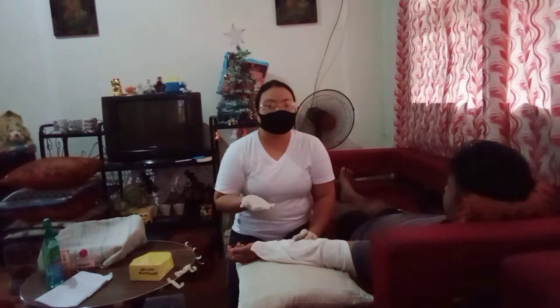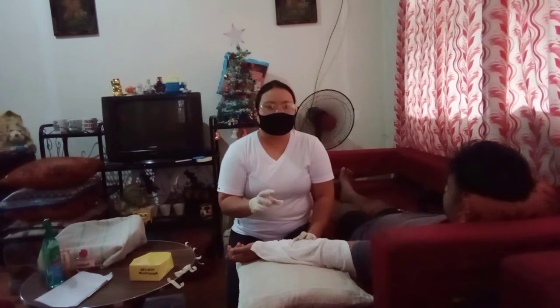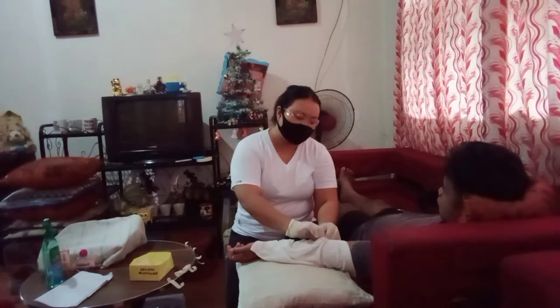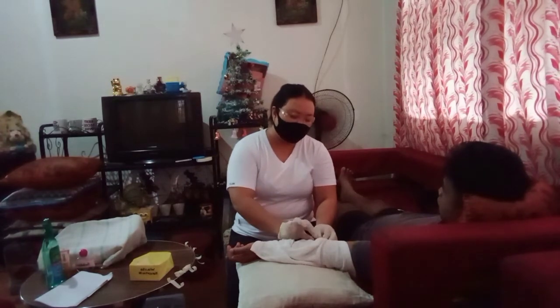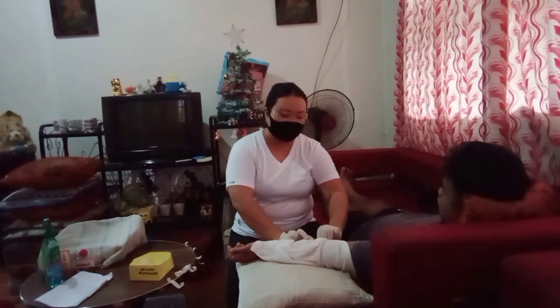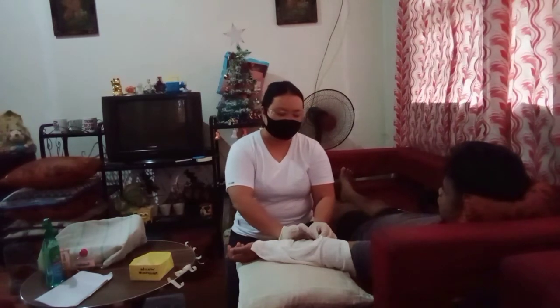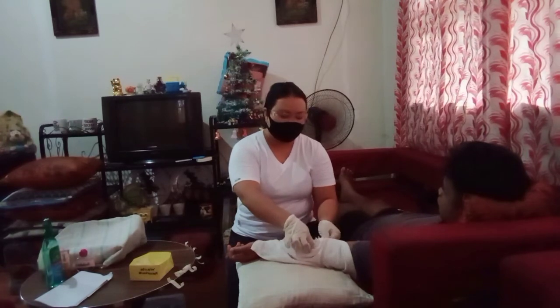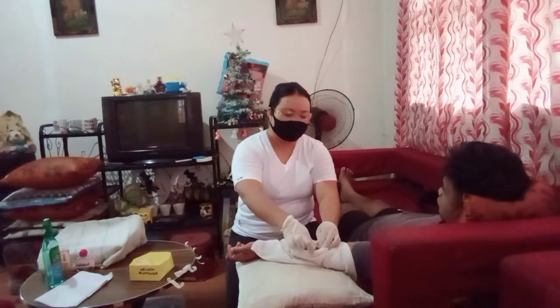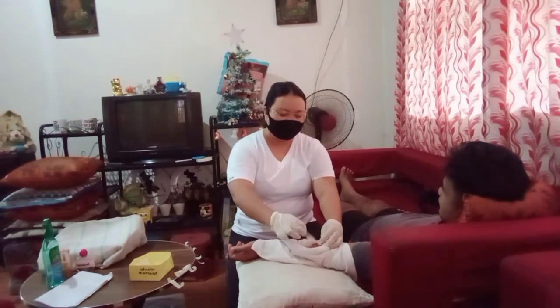Inform the patient, of course, that there is possible discomfort if it is stuck tightly. So, sir, just a little bit, sir, there may be some pain if the tape is stuck tightly. Gently remove the used gauze. It hurts, sir.